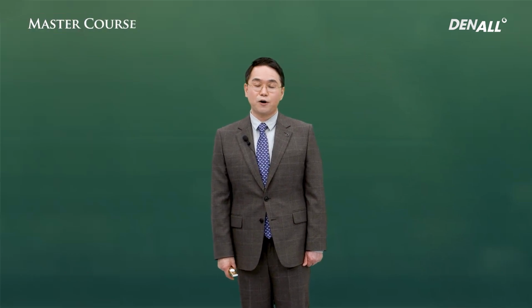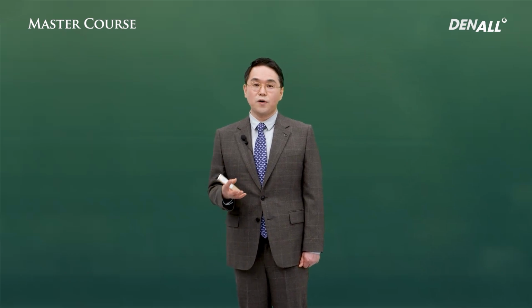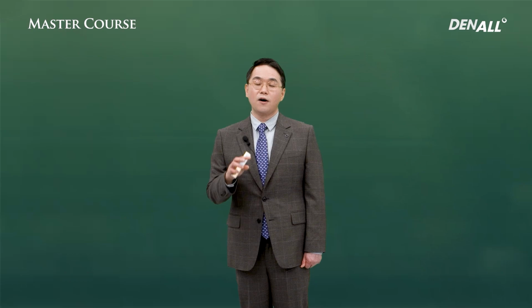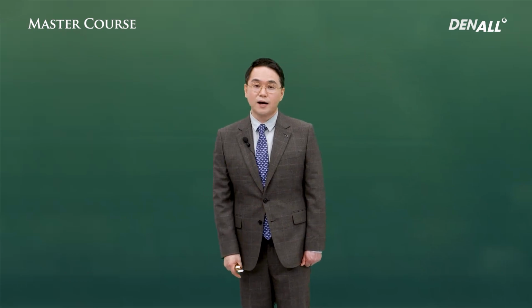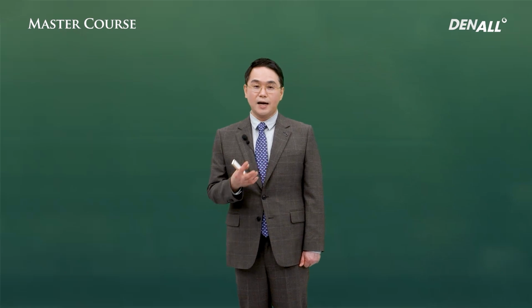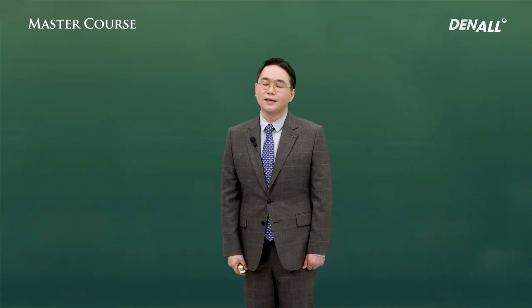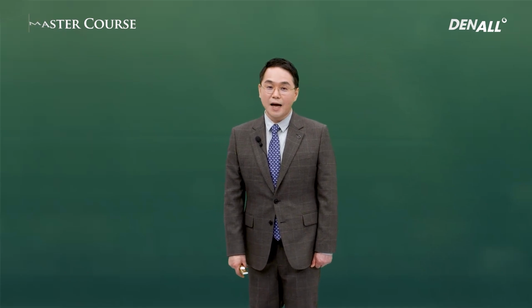In the past, we just took a CT image and applied a template to estimate where the positions should be. However, now even prosthetic design can be done, and overall treatment outcome can also be estimated. That is the big advantage.